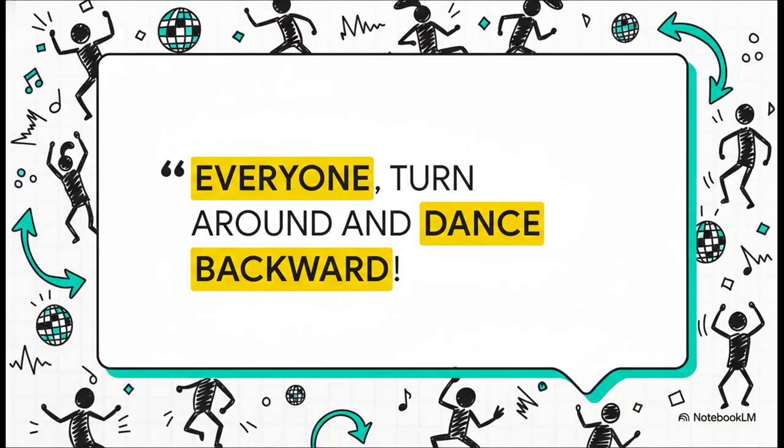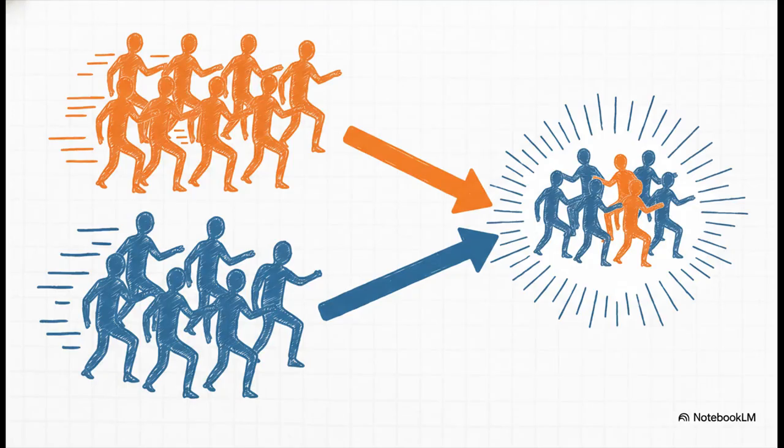So, trick number 1, we'll call it the DJ callback. The DJ waits for the chaos to build up for a very specific amount of time. Then he grabs the mic and yells out to the entire dance floor, "Everyone, turn around and dance backward." This is amazing. In MRI speak, that shout is a 180-degree pulse. And this is where the real genius is.